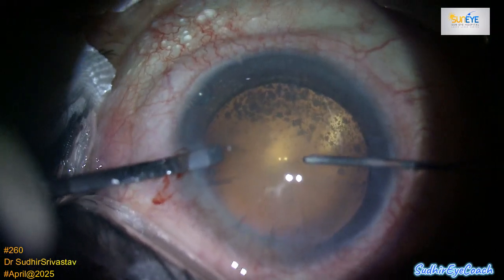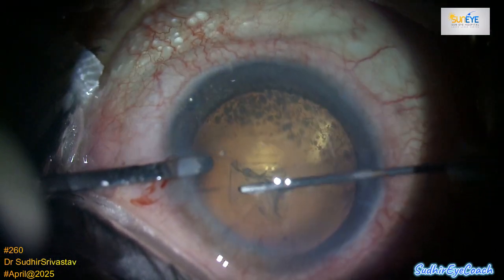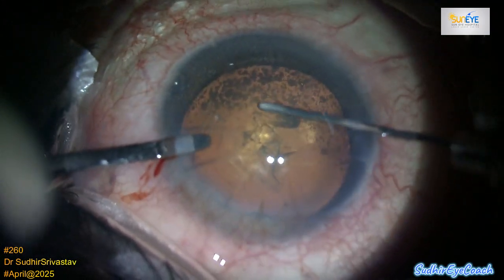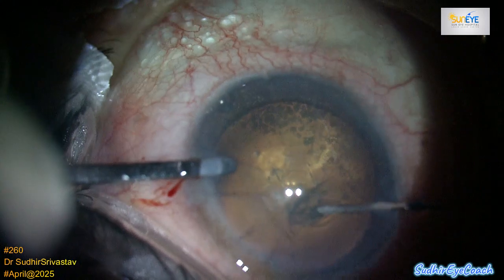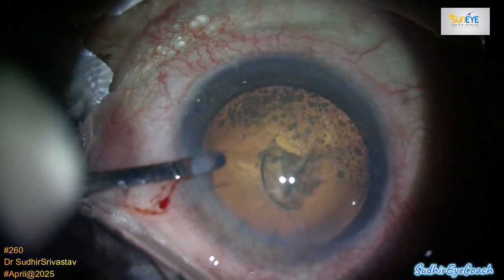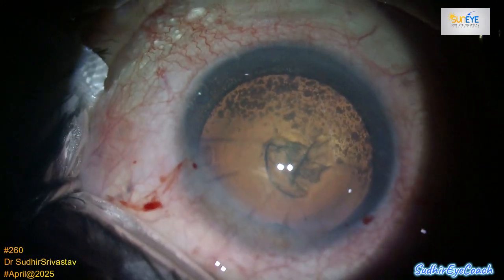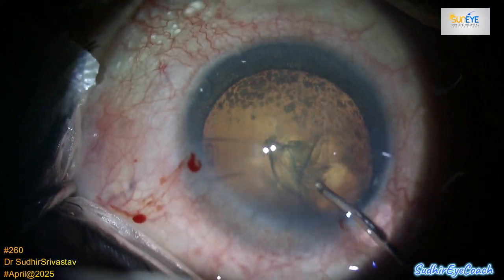In many of these post-vitrectomy cases, the posterior capsule tends to have plaques or deposits due to the presence of silicone oil and the reaction. There is usually no need to polish them, as they typically do not interfere with vision. In case of interference, in the future we can do YAG laser capsulotomy.